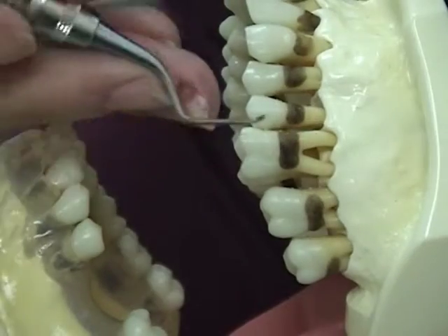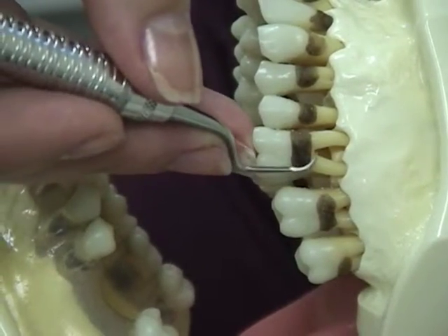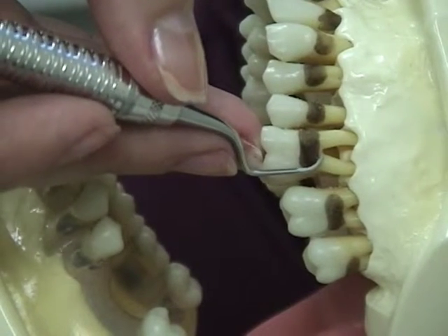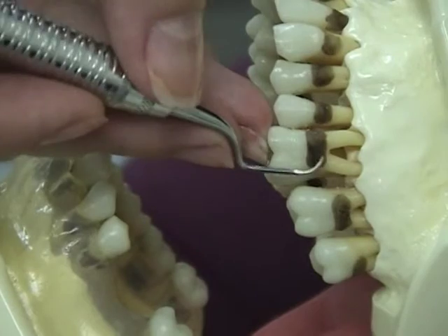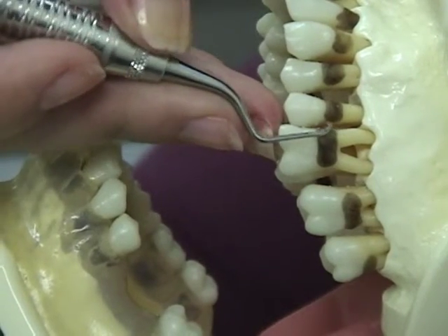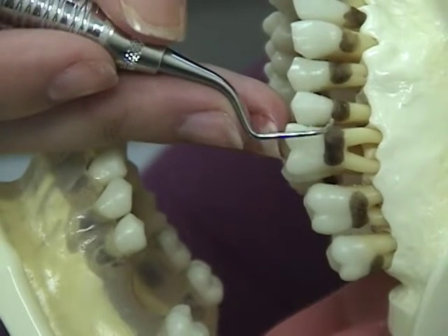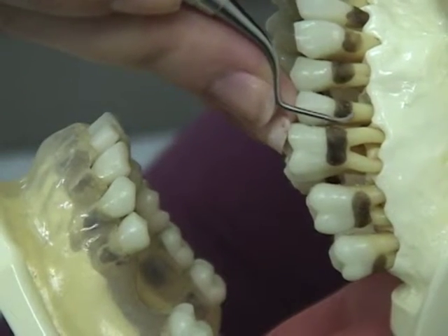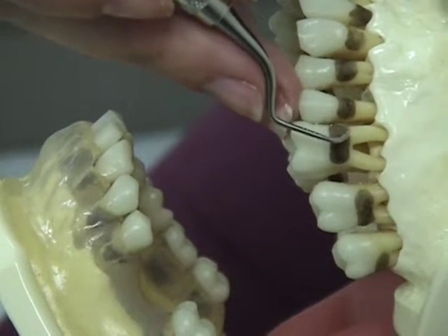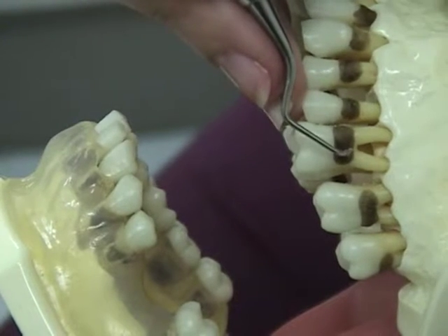Activation, pivot, and handle roll. Activation is the act of producing an instrument stroke. There are two types: assessment strokes, which are light strokes to determine tooth surface irregularities, and working strokes, which are moderate to heavy strokes to remove tooth surface deposits. The stroke is controlled by your fulcrum, which must be in contact with the tooth at all times and one to three teeth from the tooth being instrumented.